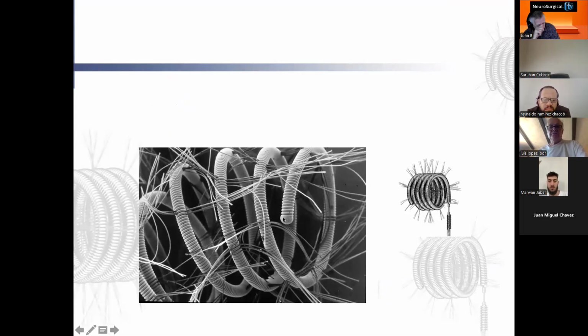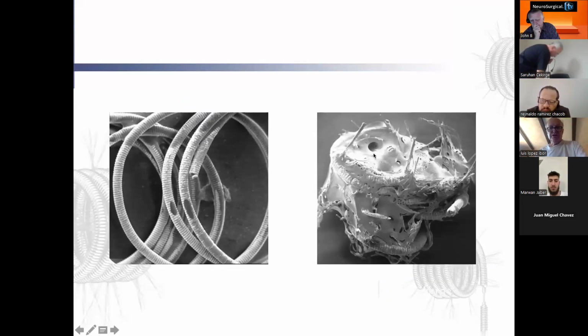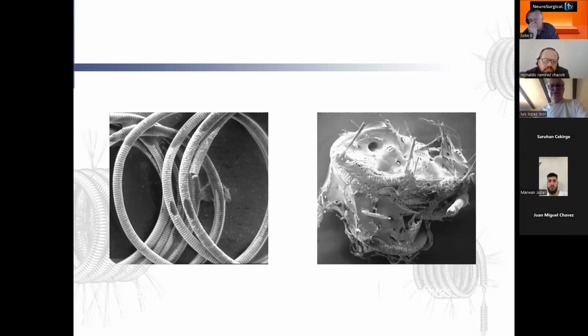When you have a pathological study, you have a clot with platelets. It's not easy to recanalize. I think it's a very good material. I don't understand why this material stopped. Henkes has a very big series. I don't know now. See, I have this material. This is an example.